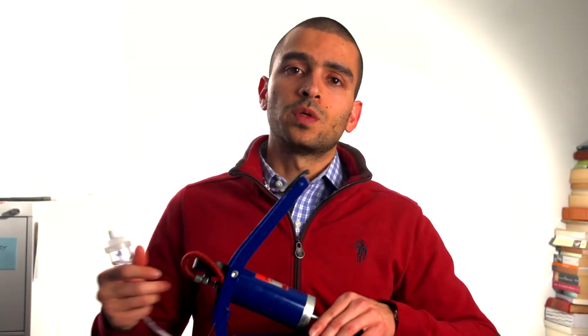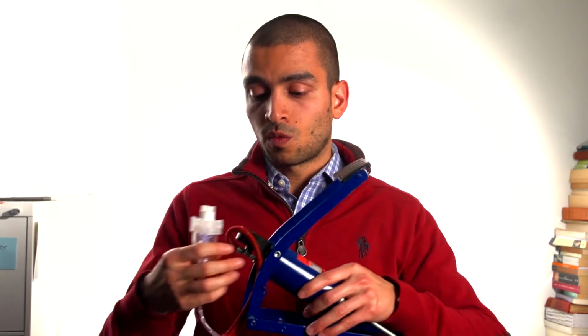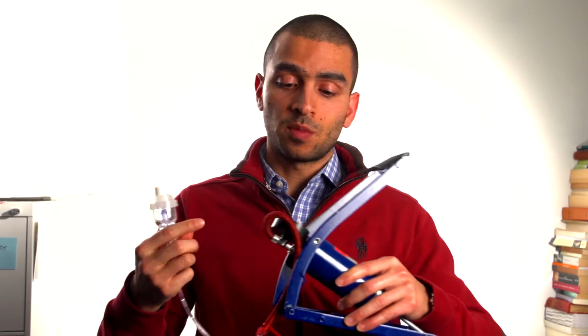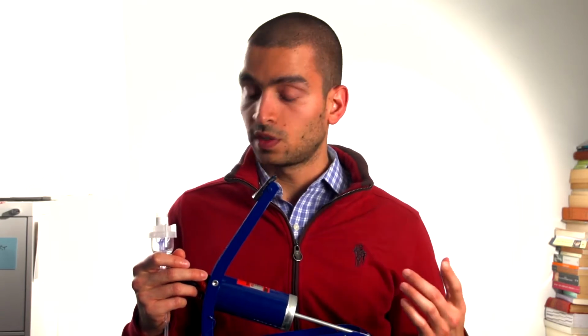One of the reasons why we chose the bike pump nebulizer is its simplicity and yet its applicability. It is currently being used in hospitals in Nicaragua where they have no electricity. And one of the things that surprised me is how easy it is to assemble. It's basically just a bike pump that you can get at a hardware store or a bike store, and then the filter and the rest of the components. The D-Lab is doing a lot of really cool stuff that is available online, and it could be good class projects that teachers could have with their students. That way we can engage children early on in making all these really applicable things.